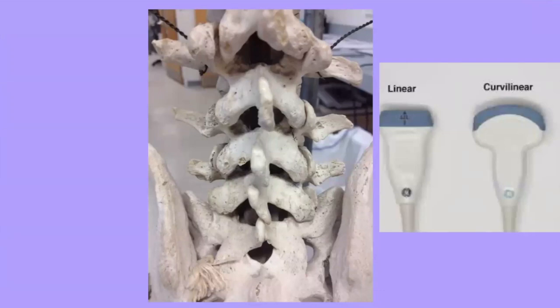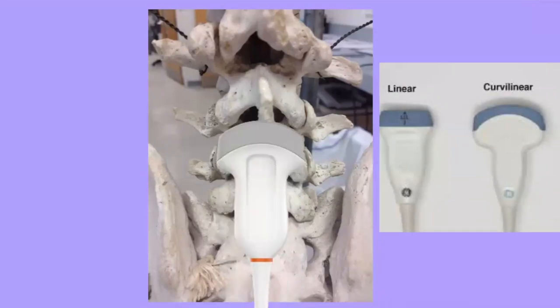You can even use the phased array probe or the cardiac probe if you want, especially if someone has abnormal spinal anatomy, they've had surgeries, and it's a really small space to get through. As long as you can set the depth of your probe to at least 8 centimeters, you can use whatever probe that you want. So I'm going to talk about the curvilinear probe, but it really doesn't matter so much. What does matter is making sure that your probe is perpendicular to the skin and avoiding fanning.